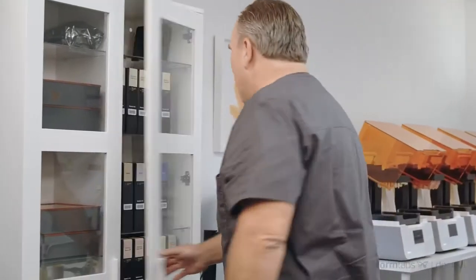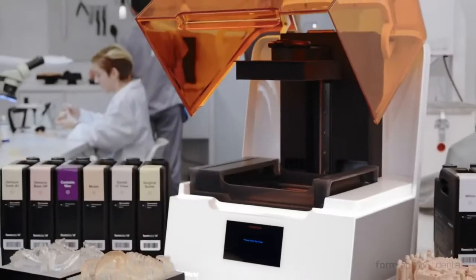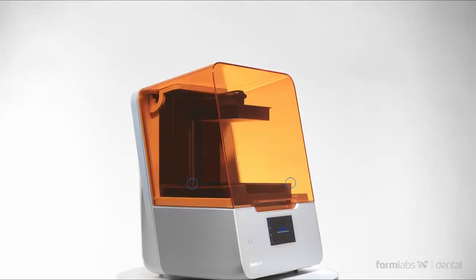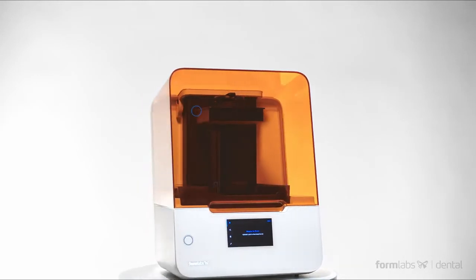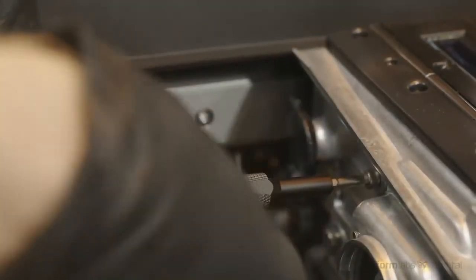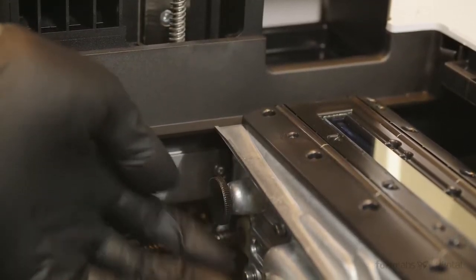We know your business can't afford to slow down. That's why we designed the Form 3B to be our most reliable printer ever. New smart sensors constantly monitor print progress and keep you informed and ready to promptly address potential issues. We usually run smaller batches of parts during the day and use remote printing to monitor larger builds that run during the night. We also made it easier for users to replace many of the Form 3B's major components themselves, minimizing the need to send a printer in for repairs and increasing uptime.